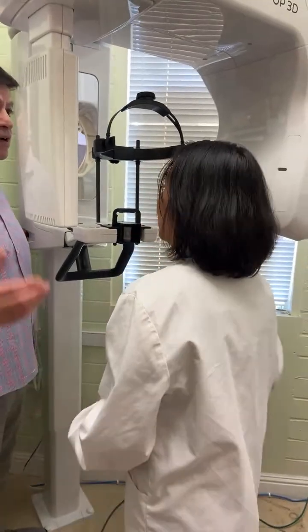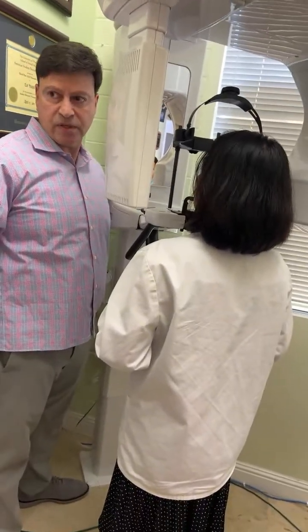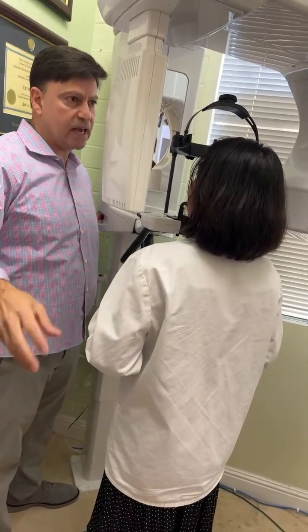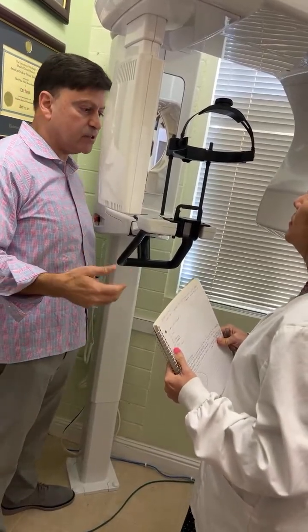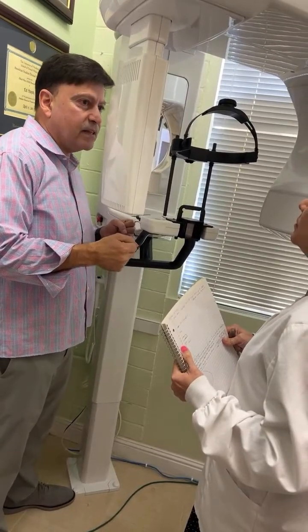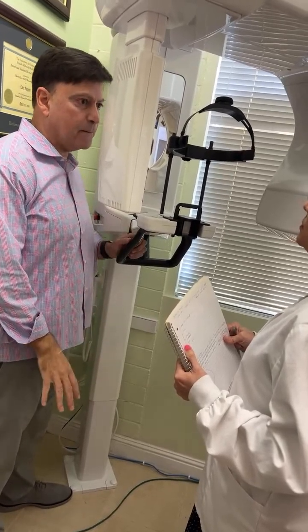People that are very tall, patients obviously 6 foot and above, might be difficult for you to position. So you would sit them down, and have a chair that has casters, like a wheelchair. You don't want them to slide around under the device. Elderly patients that can't sit still for a CT, they shake and can't stay still, it's best to sit them down. Patients that have very broad shoulders, sit them down.